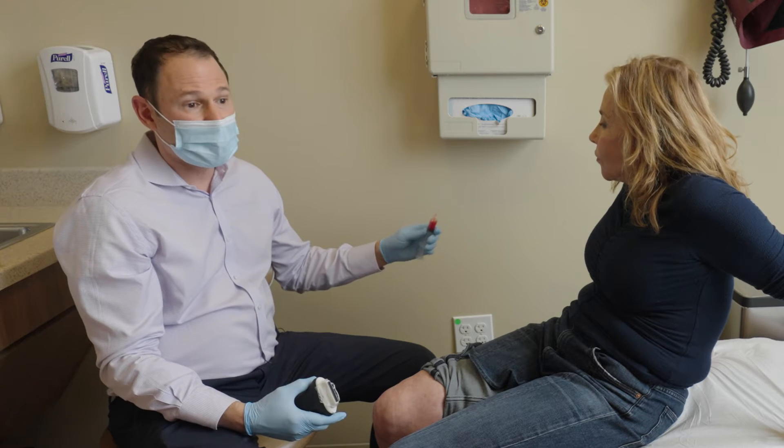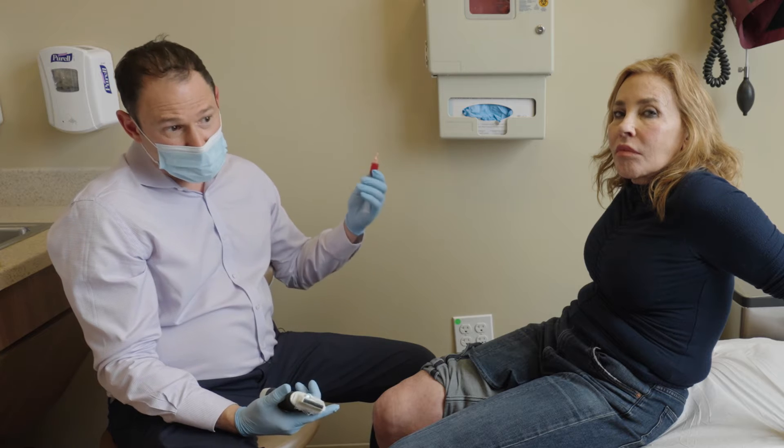I have about four mLs of PRP that we just spun out, and now I'm going to do a joint injection.